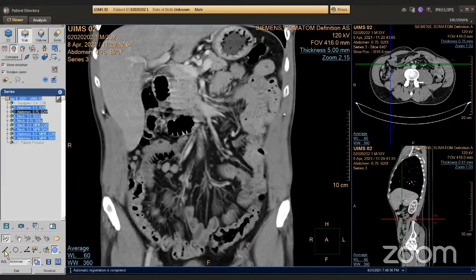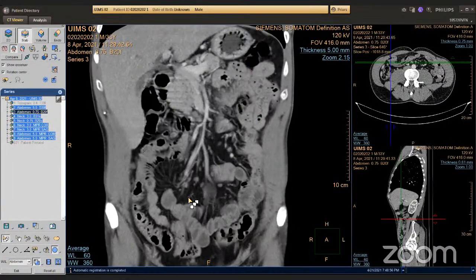Still, it can be viruses. It can be just normal. The patient can have some kind of a malnutrition thing. Celiac disease can do that, and so on. Or it just can be there without any cause. 16 millimeters is an enlarged lymph node.